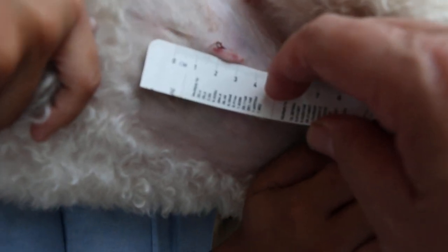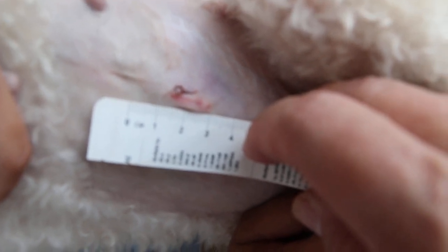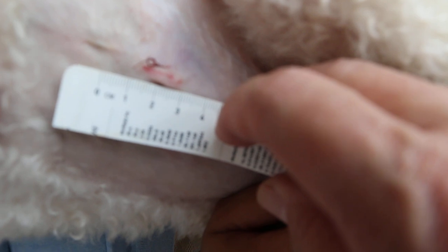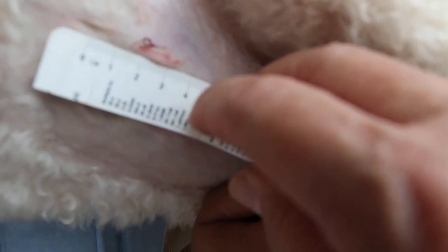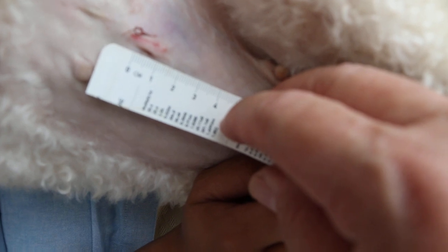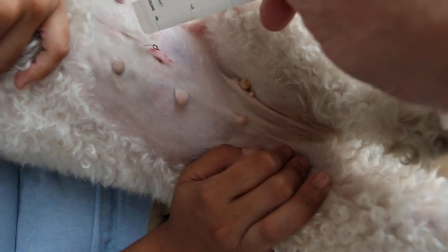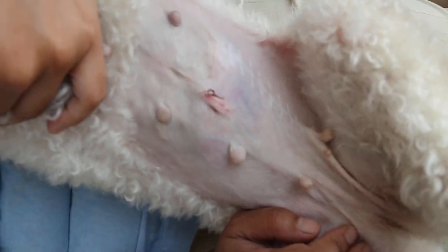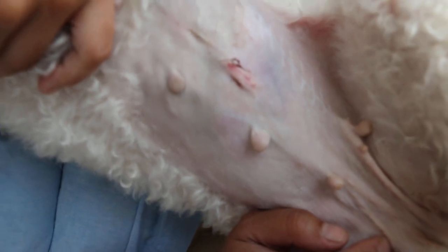Before you incise the skin, you incise for about 1.5 centimeters, and you will be in the right spot to achieve such a small wound. This is the horizontal mattress suture, and you may need to put a plaster on, but you can see the wound is healing very well.